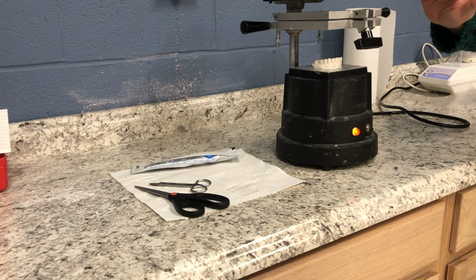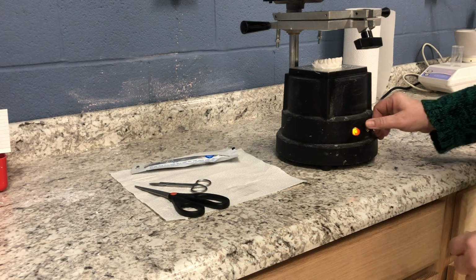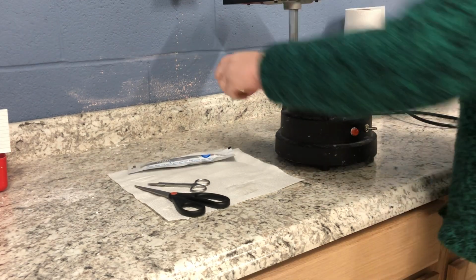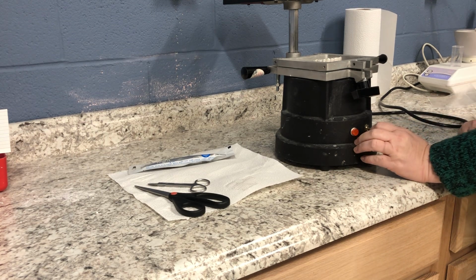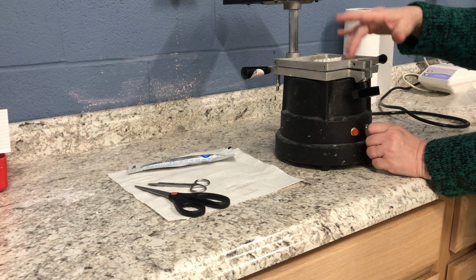So right now I'm seeing the material kind of rise up a little bit and then fall. Kind of reminds me of a souffle. Let me see what that looks like in the camera. If you can see, and it's starting to drop. Just a little bit more. There you go, you can see that. So I'm going to turn this on. Now I'm going to turn this off so you can hear me, but this is still tacky like the back of a Post-it. So I'm going to keep going until it loses that tackiness.